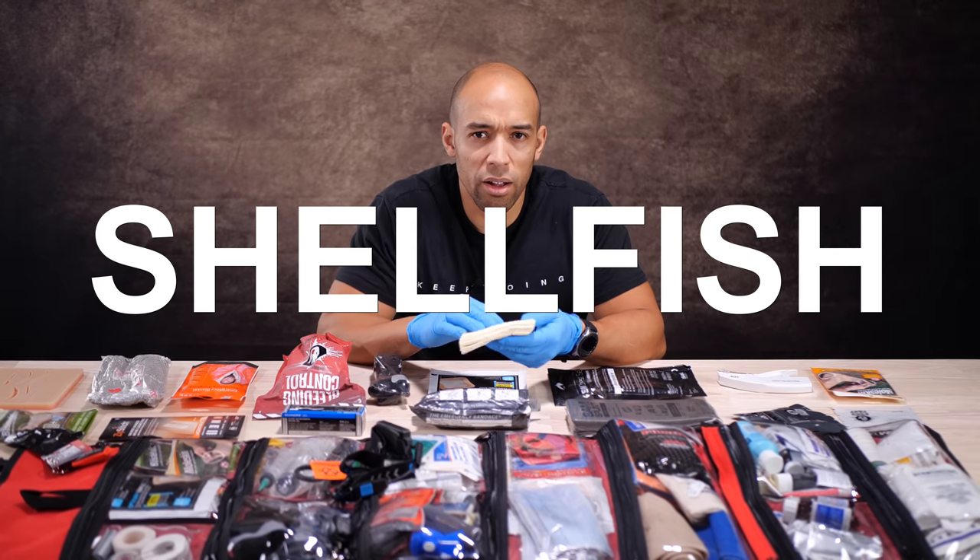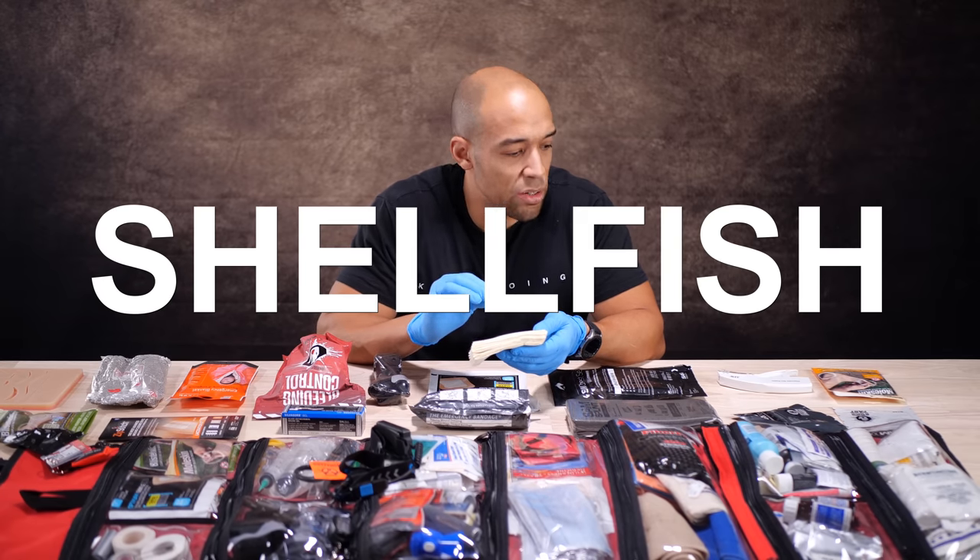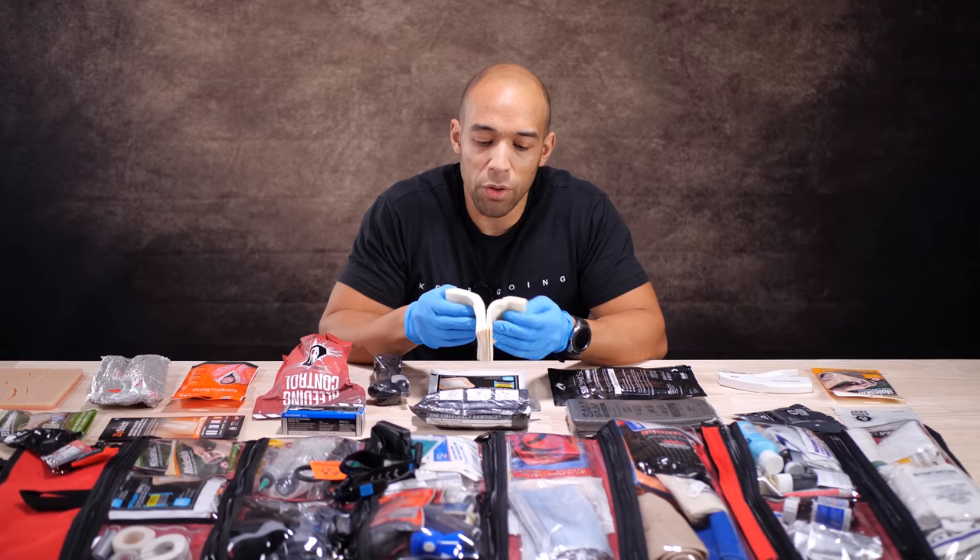This is the Chitosan bandage — it has a seashell-derived material, and Chitosan has an interesting smell to it. I'm going to rewrap this, because if we're talking about a real emergency, stranded in the wilderness with nothing else, are you really not going to use a potentially non-sterile bandage? I'm not saying do it — definitely not saying do it — but if it's all you got, it's all you got.